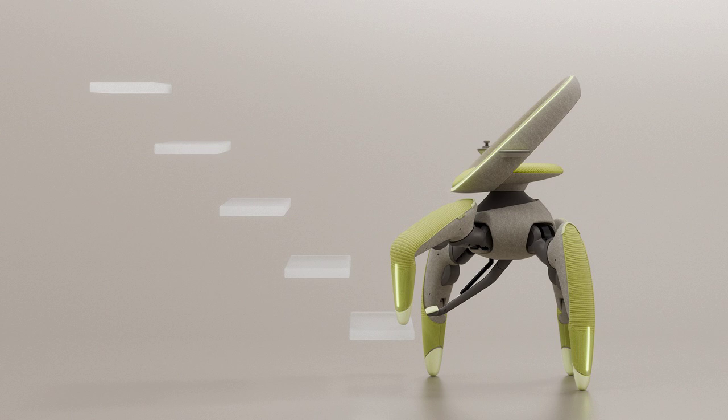The WalkMe, a robotic chair designed to provide unprecedented levels of mobility for individuals with limited physical capabilities. This innovative device, resembling a friendly crab, goes beyond the functionality of traditional wheelchairs by enabling users to navigate stairs, overcome obstacles, and even access vehicles with ease.